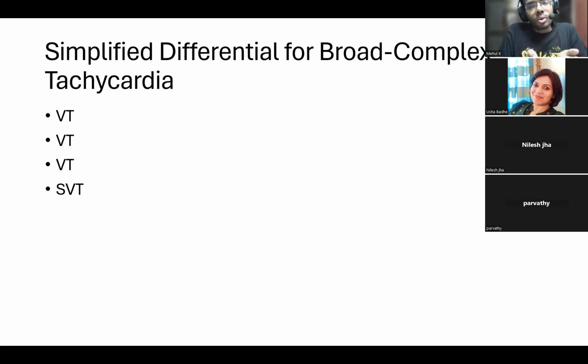So if you get a broad complex tachycardia, what is your thought process going to be? It has to be number one, number two, number three, VT. Number one, number two, number three is always going to be VT. Only afterwards do we even consider the diagnosis of SVT.